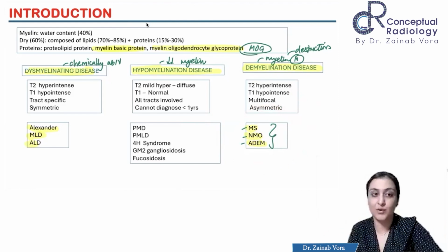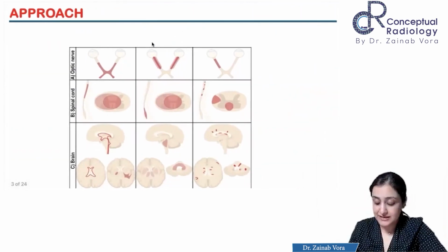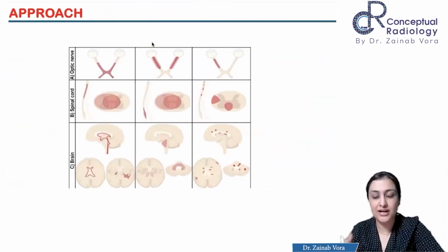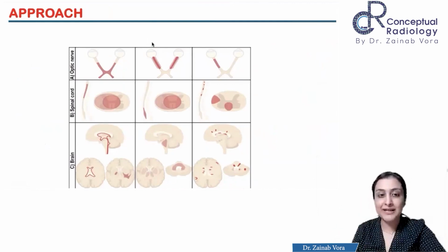So that's the whole outline. I hope that's clear to all of you. Now, when we have these three diseases, I'm going to teach you three patterns at the outset only so that now we can just see cases and learn more about them. This is the pattern that you remember.